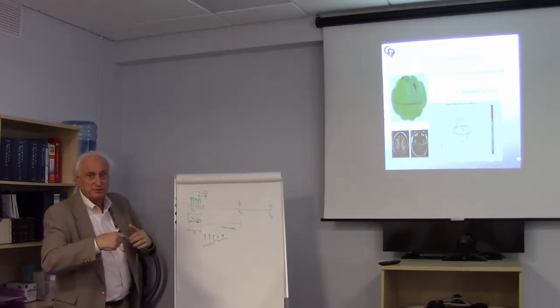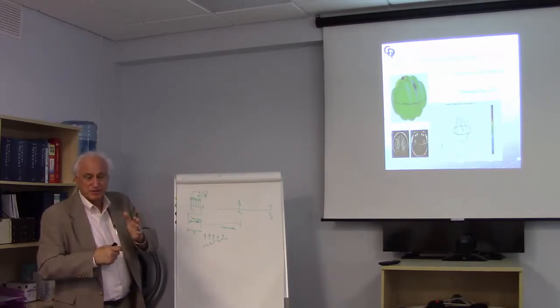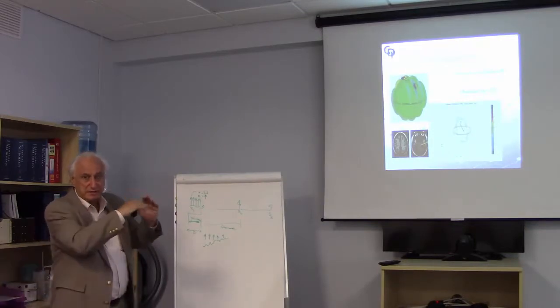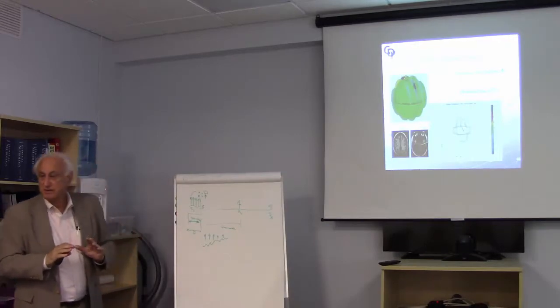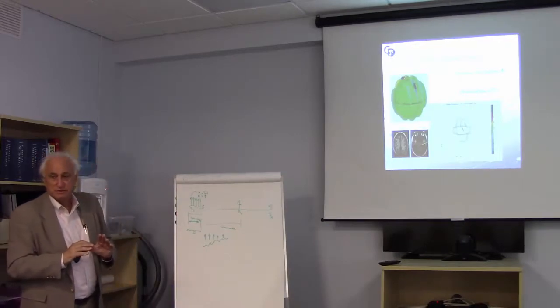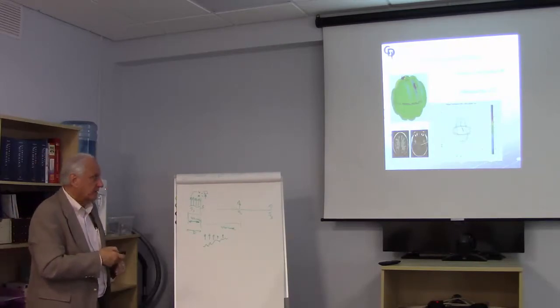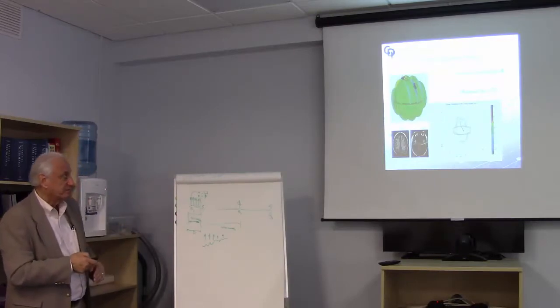Their real utility is in protecting the corticospinal tracts, either in the brain itself or when you get down into the brainstem or into the spinal cord, but not at the motor cortex level. And that's an important thing to think about, depending on what the operation is and the goal of the operation. So this was a computational model that we put out a few years ago.